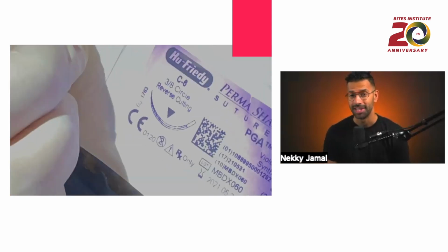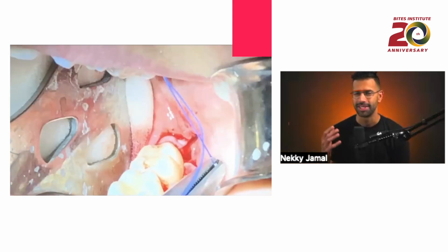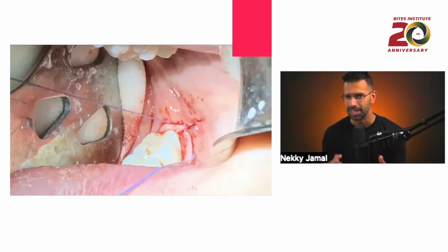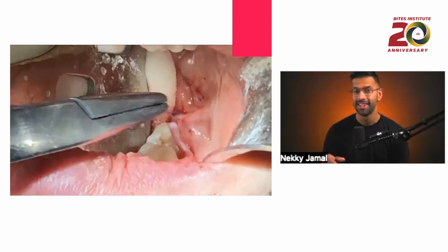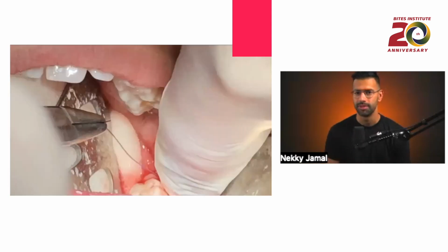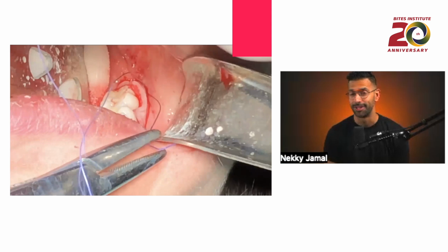Now, my recommendation for you, if you take anything out of this here today, is you don't need to tie the patient back up like a zipper. Okay, you don't need to tie that flap completely shut. There have been multiple studies to show that you will have better healing if you heal by secondary intention after the extraction of a wisdom tooth. So I only put one suture right distal to the third molar, and I've had phenomenal success. It's so much easier on me.